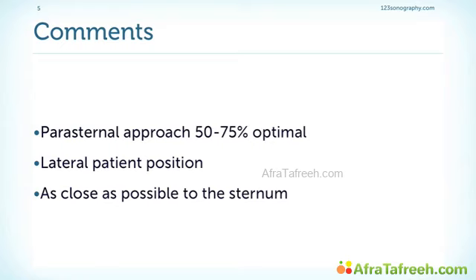Important to know that the parasternal window does not work in all patients, but usually you get image quality, I would say, probably in two thirds of patients. Always bring the patient in a very lateral position and try to stay as close to the sternum with your transducer as possible.